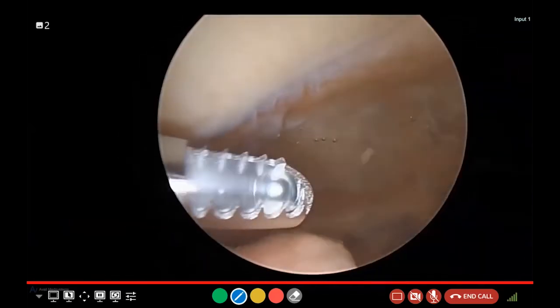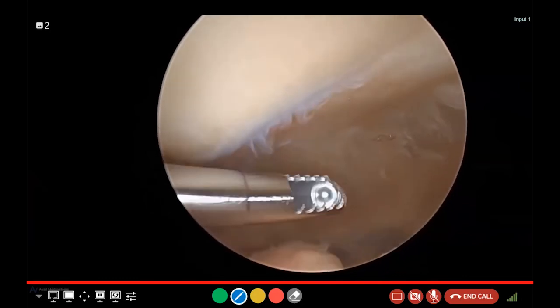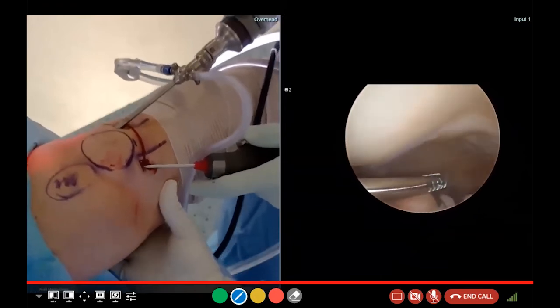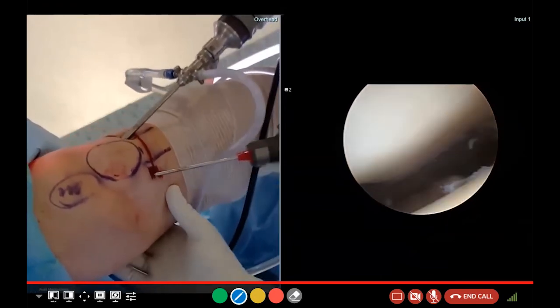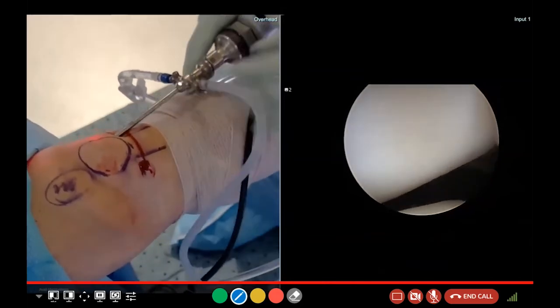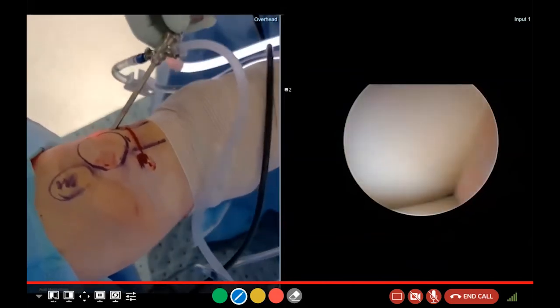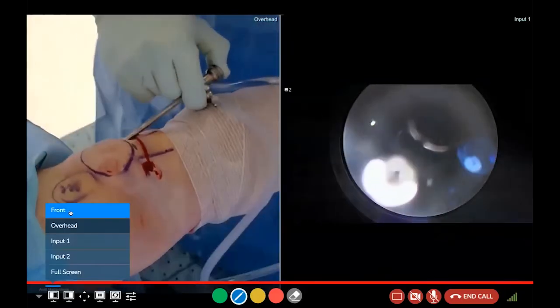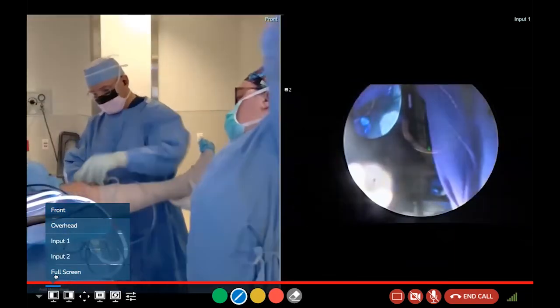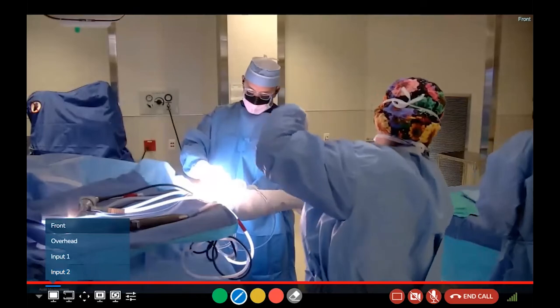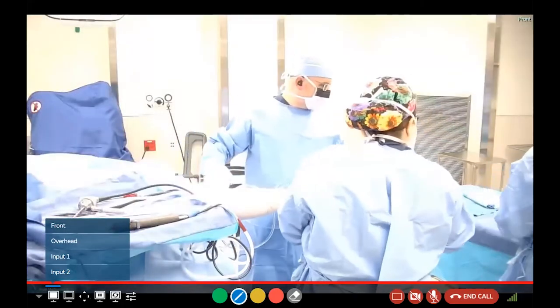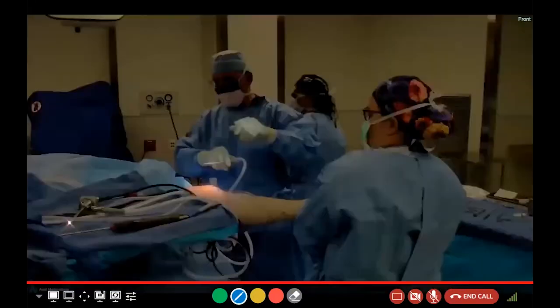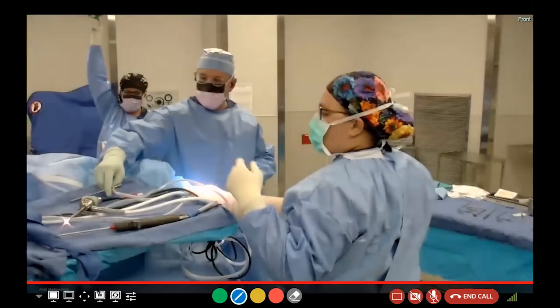Go ahead and massage the joint. I'm going to have the team just pump the joint to make sure I get all those loose bodies that are trying to hide. I'm going to remove everything, suck all the water out, remove the instruments, and on to the next case. We're going to close it.